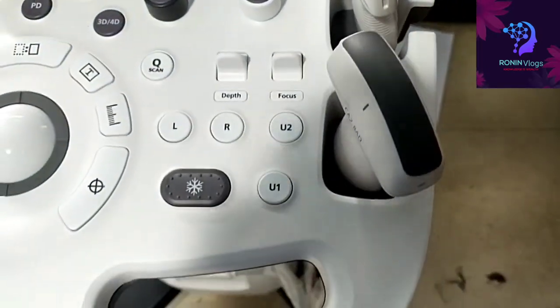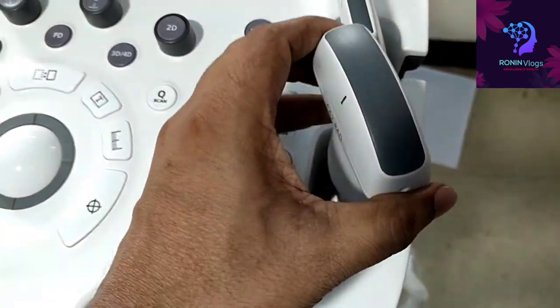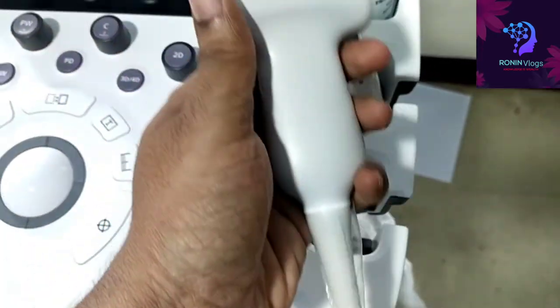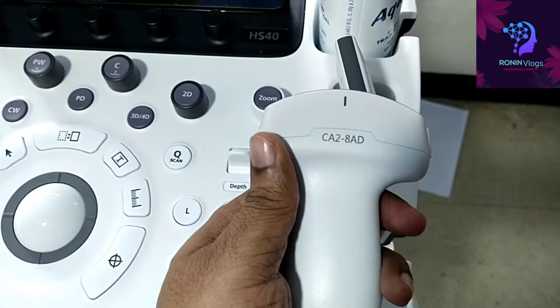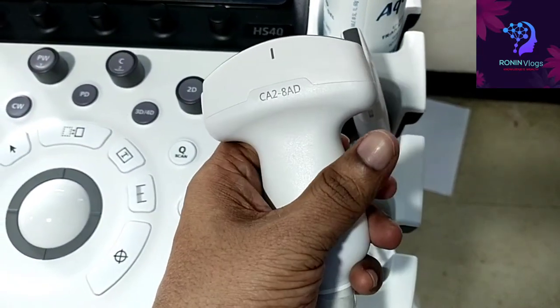This is the control unit, and these are the two probes: convex probe and linear probe.